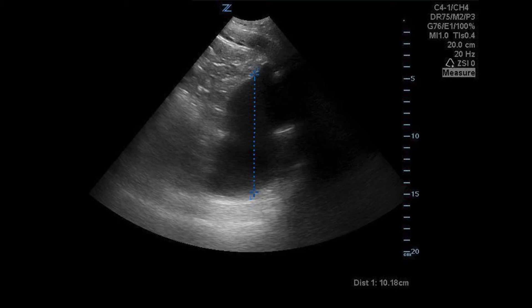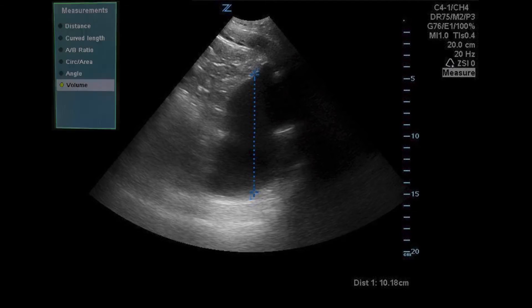You can switch between the two active ends of the calipers with the set key. The active end being moved by the trackball is highlighted in green. If you need to do more complex measurements such as bladder volume, press the measure key twice and the measurement menu will pop up.